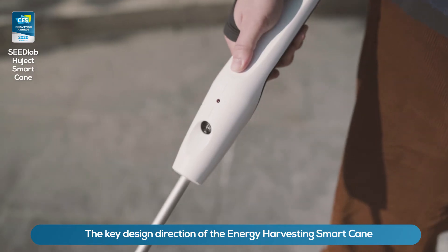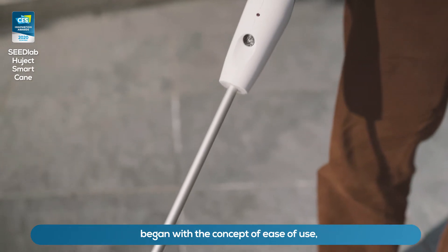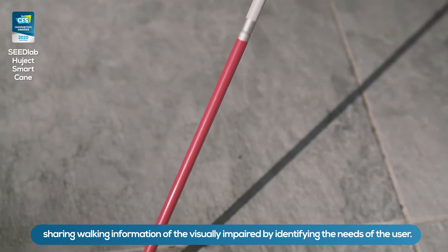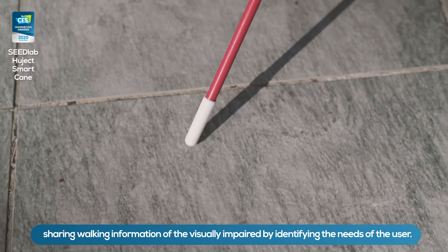The key design direction of the energy harvesting smart cane began with the concept of ease of use, sharing walking information of the visually impaired by identifying the needs of the user.